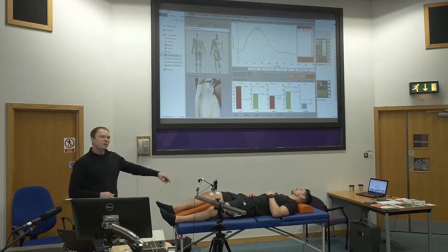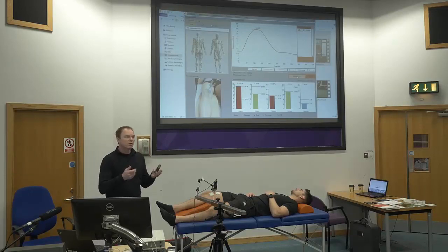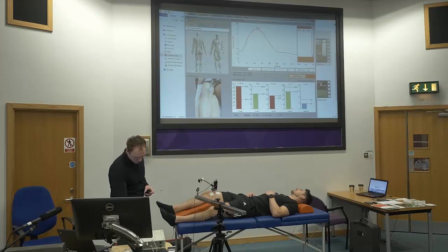I don't know if you saw the muscle movement — that's the response we got. To look at these numbers wouldn't make any sense, because you can see the contraction time is 60% slower than the average, because we just stimulated one small part of the muscle. So we'll go to around 30 and measure again.